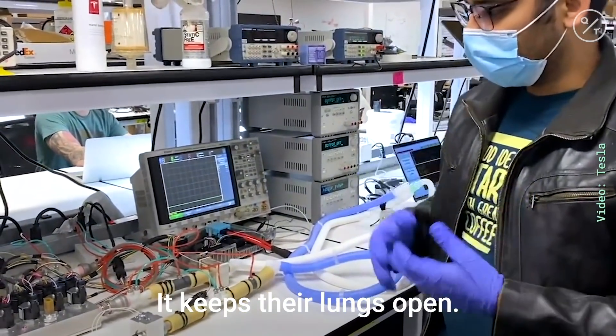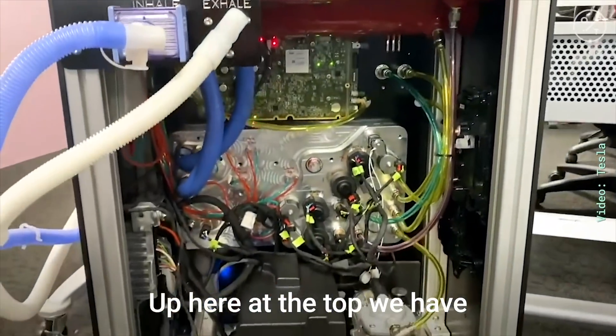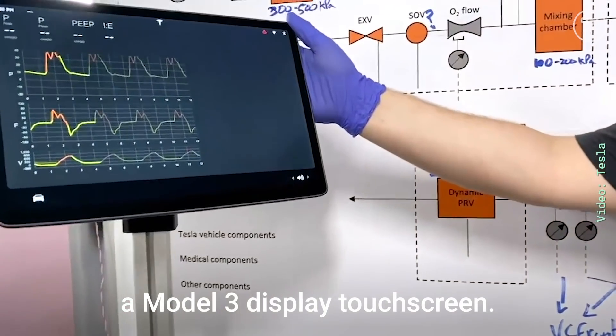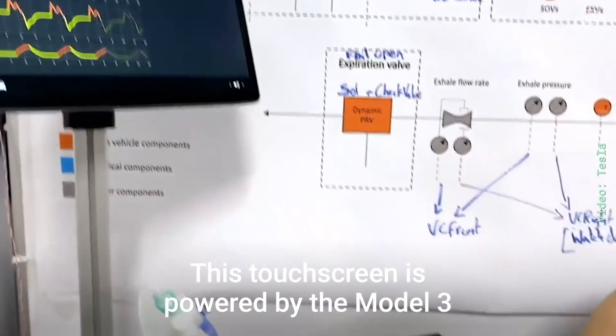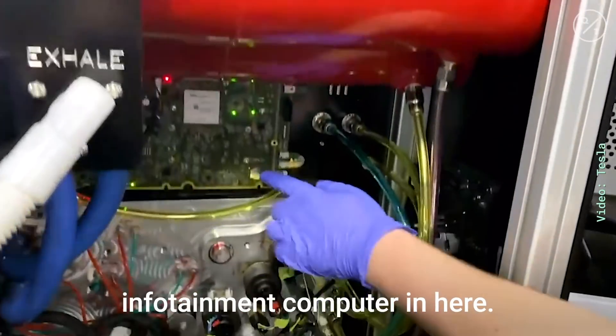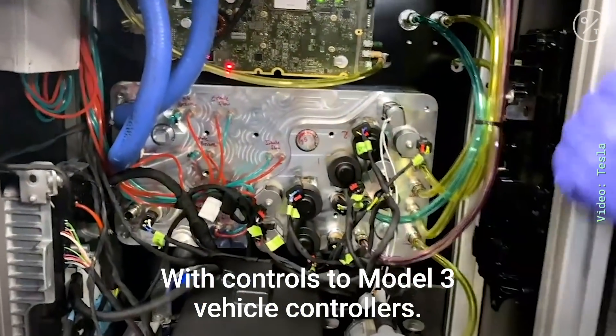This system is powered by the Model 3 infotainment system. Up here at the top we have a Model 3 center display touch screen. This touch screen is powered by the Model 3 infotainment computer in here which controls Model 3 vehicle controllers.